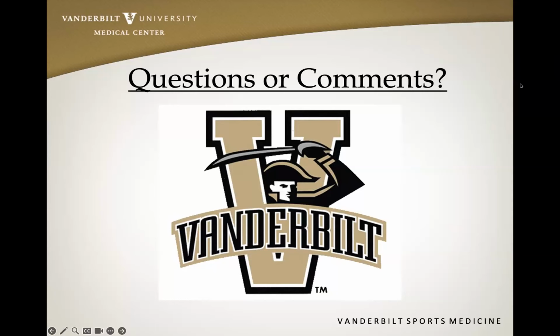Yeah, that's a great question. That's something that at a couple of recent AMSSM meetings people have been talking about and trying to do a little bit more scanning in these ligaments, especially on the ulnar side of the wrist, as it applies to TFCC. And I've spent some time looking at them.